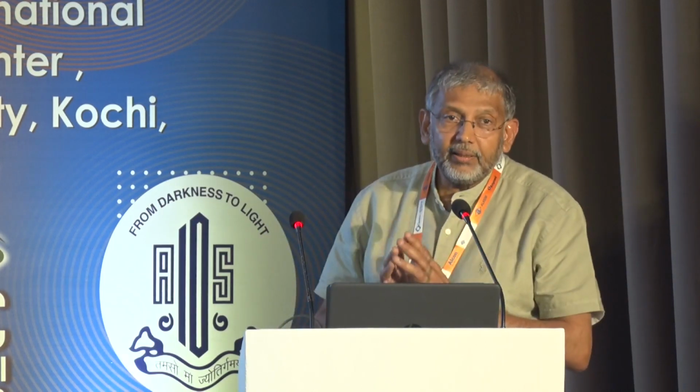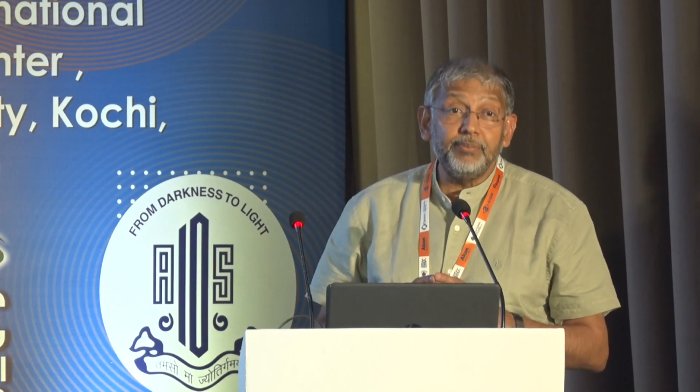Because spherical defocus and the spherical aberration have a summation effect when they act together, because our eye works as a whole. So this is how you choose a lens of a specific asphericity depending upon the corneal asphericity.